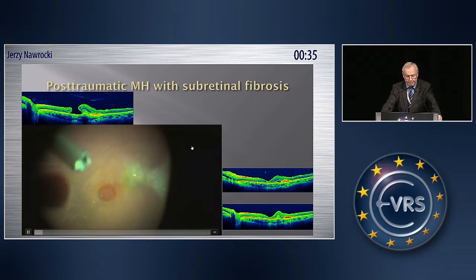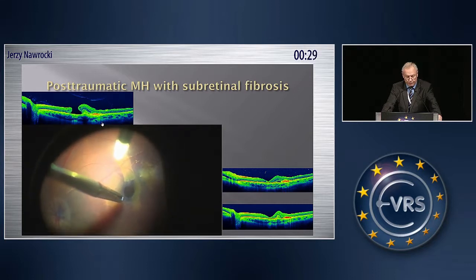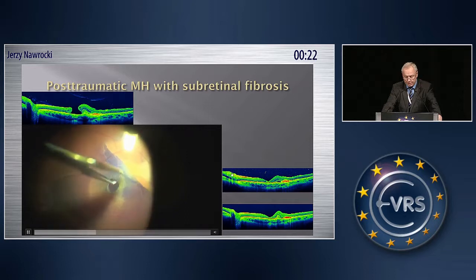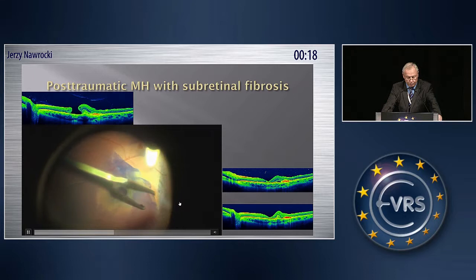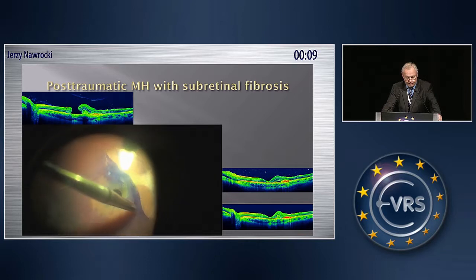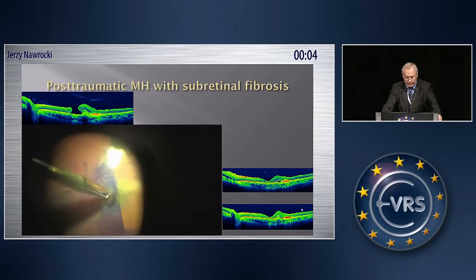And here you see some examples. Here is a traumatic macular hole with subretinal fibrosis treated with the inverted ILM flap technique. You see the surgical approach, the preoperative swept source OCT image and the postoperative image. And as we currently do, I do not trim the flap. And here you see a relatively large flap covering the macular hole by the end of surgery, which enabled us to close this difficult case.